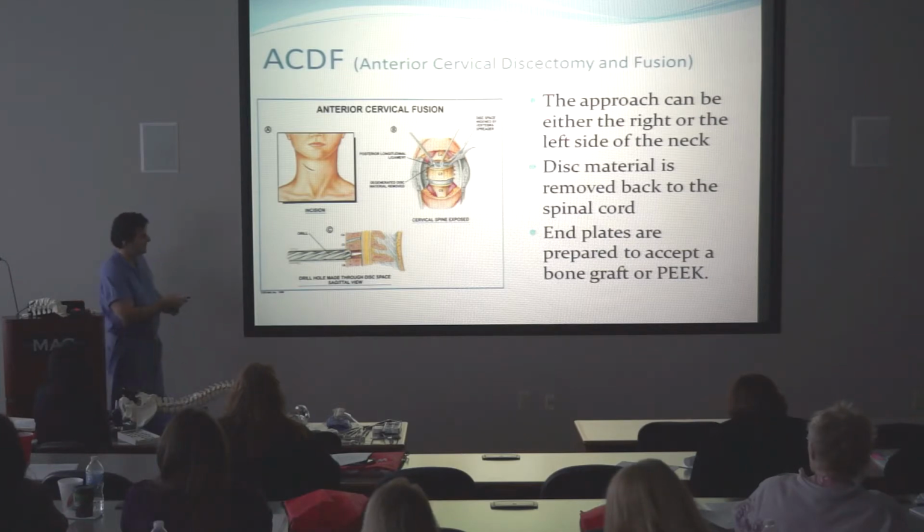And you'll see that subsidence when these two bones come close together much more readily with bone when you use a bone plug in there as opposed to a spacer. The spacer will not give, it just won't. It'll stay and maintain that height without fail. So that's the reason I tend to use spacers. Other docs may like to use bone because it works better in their hands.